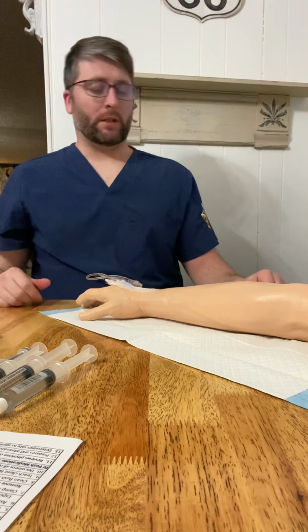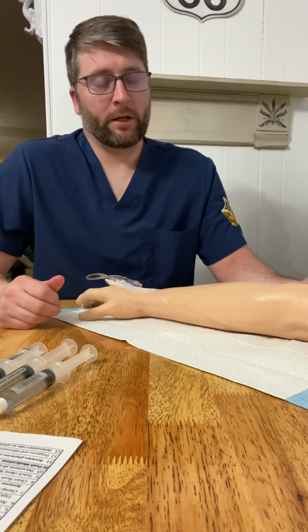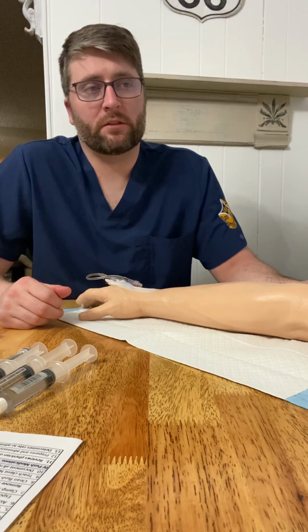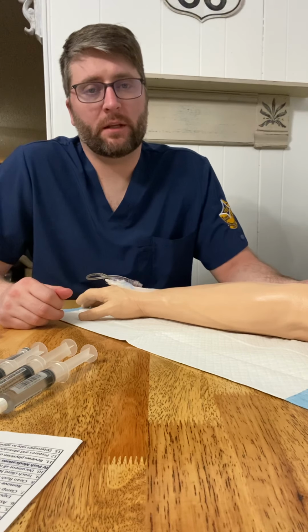Hello, we are going to be converting our continuous IV to a saline lock. We are going to prepare and administer our medication according to the 6 rights of medication administration, which are right patient, right drug, right dose, right route, right time, and right documentation.